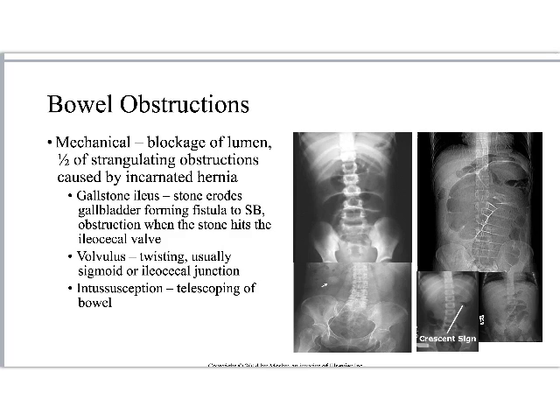We could also have a volvulus, which is a twisting, usually at the sigmoid or ileocecal junction. So the bowel gets twisted up, either at the area of the sigmoid colon on the patient's left or at the area of the ileocecal valve on the patient's right. It's like it's tied up in knots. Or an intussusception. In this case, it's a telescoping. The bowel has telescoped within itself, and this is also a really popular test question, because this is one of those things where a barium enema is both diagnostic and potentially therapeutic.